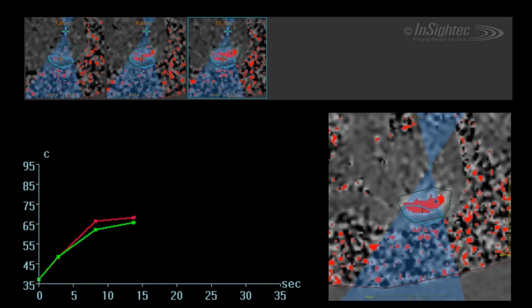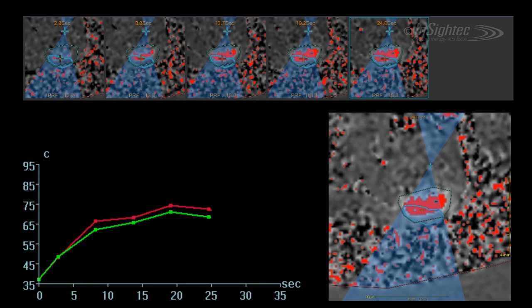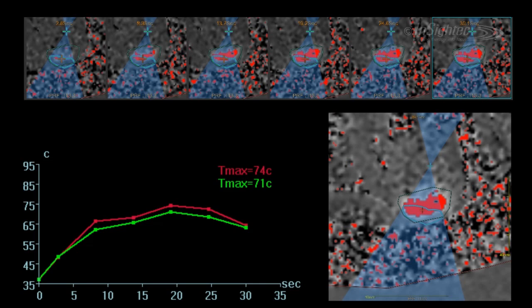MRI provides real-time measurement of thermal changes in the tissue. Every five seconds during the sonication, a new thermal MR image is acquired and temperature rise is displayed. If the rise is insufficient, parameters can be adjusted to achieve the desired temperature.